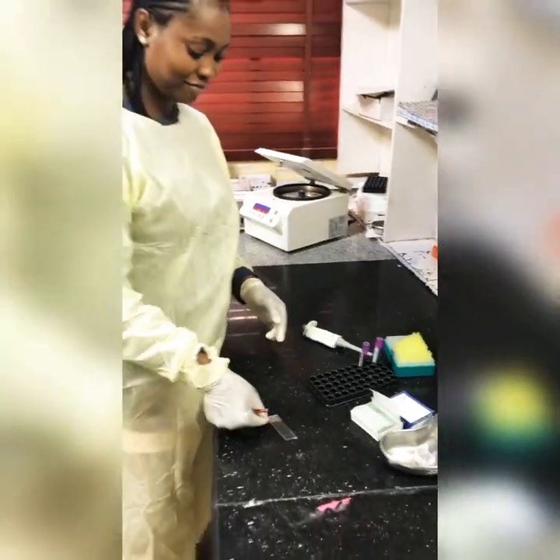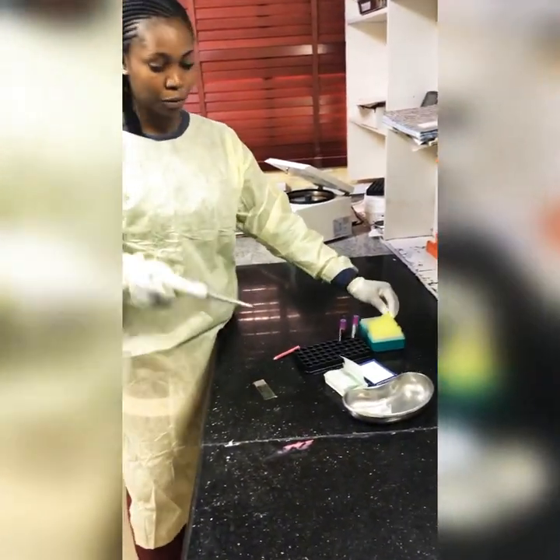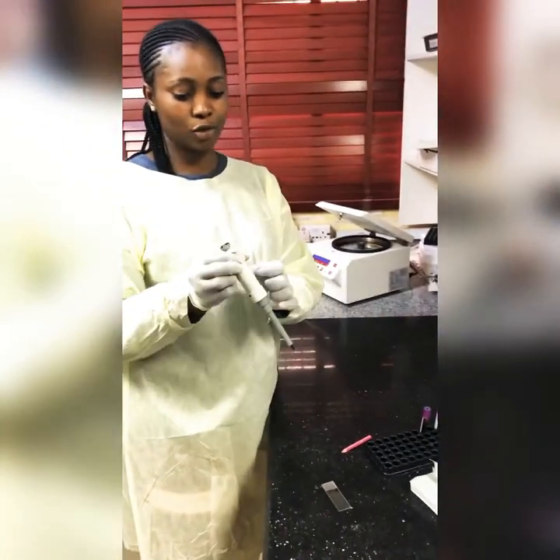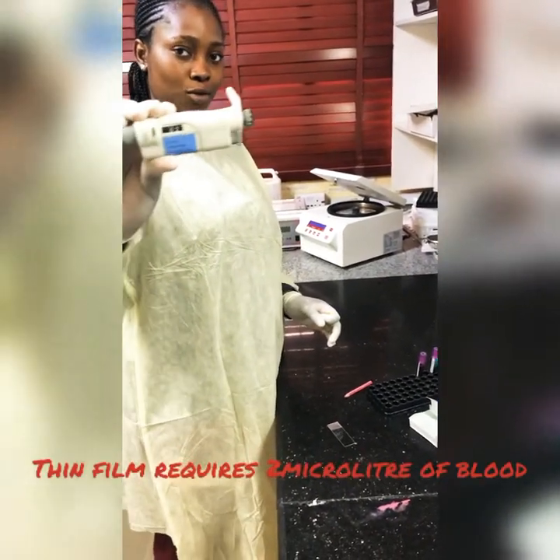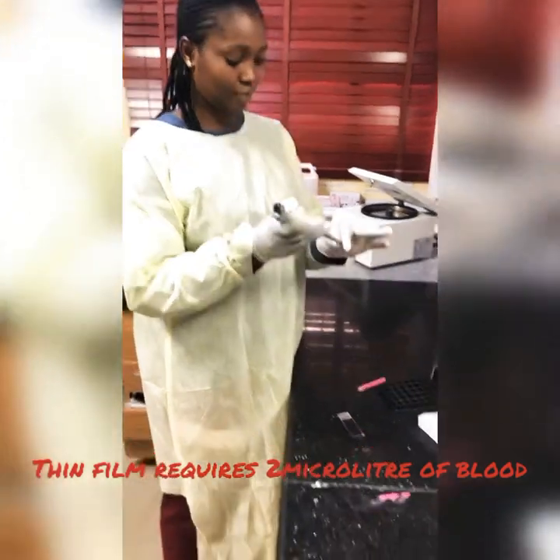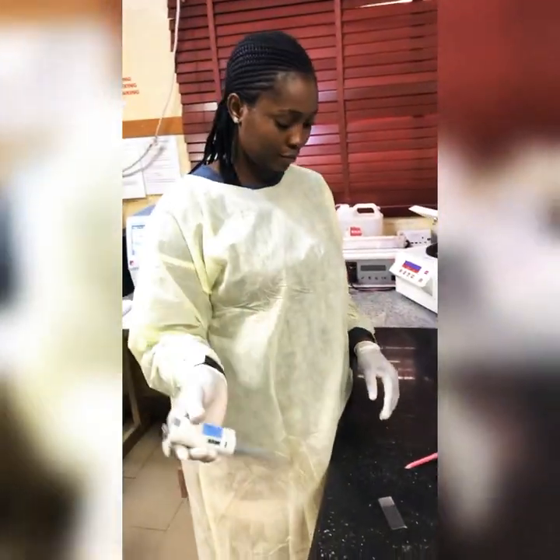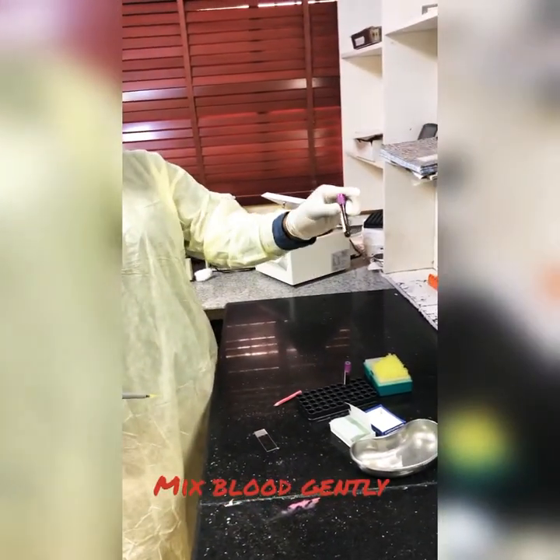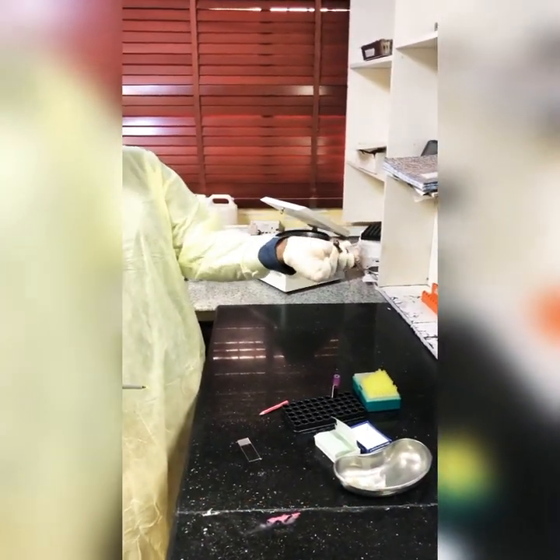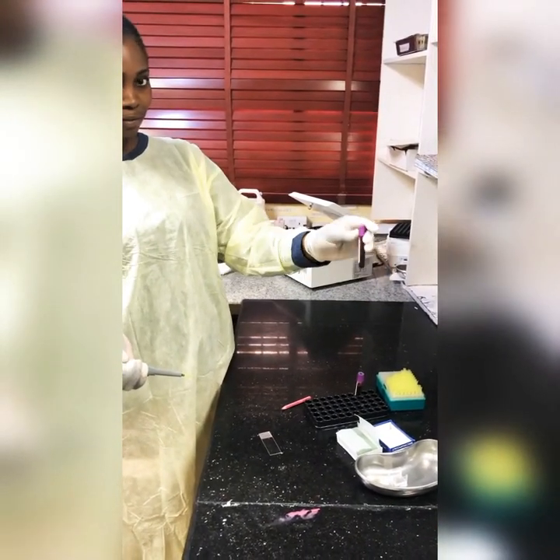Next, we get our micropipettes, which is what we use to pick our blood sample. We insert our pipette tip. To make a thin film, we need two microliters of blood. But before picking, we have to mix gently to get a homogeneous blood mixture — mix very, very slowly, not too fast.